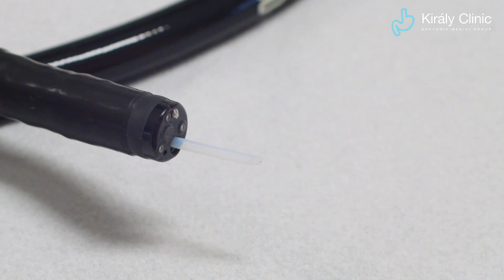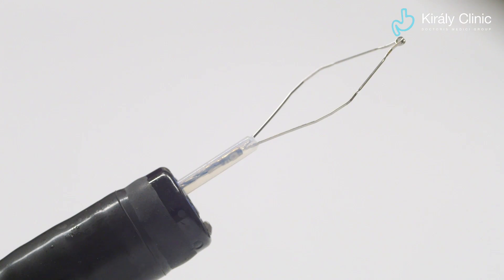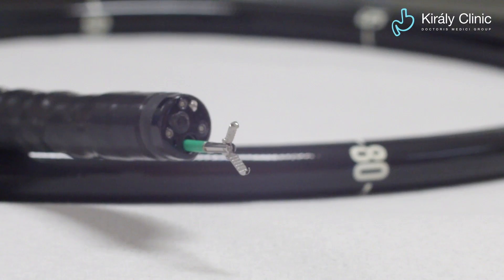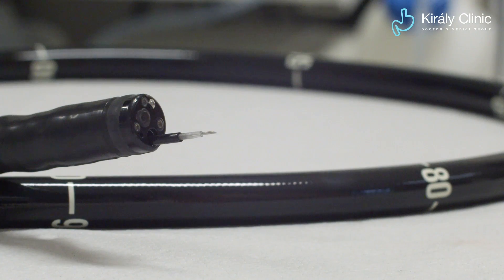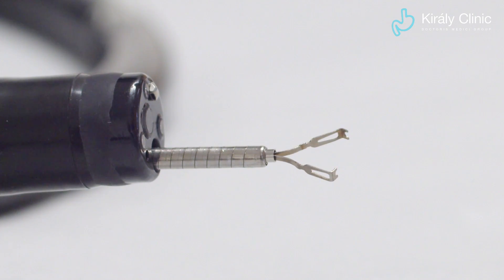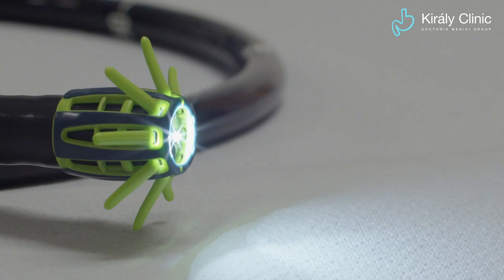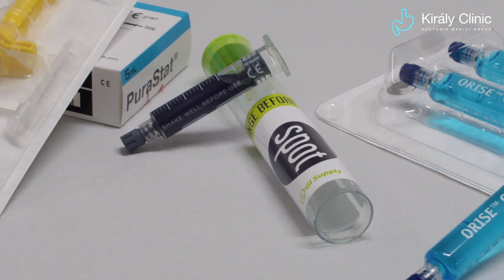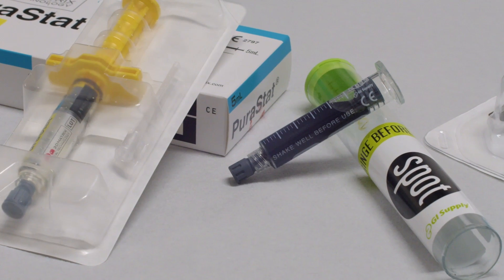Through the endoscope working channel, forceps, electrical loops, cutting tools, tissue and foreign body gripping devices, injectors, hemoclips, rubber band ligators, caps, and hemostatic gels can be delivered into the colon to perform surgical intervention or to stop bleeding.